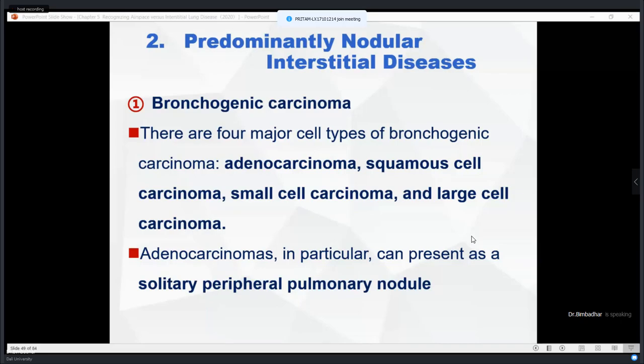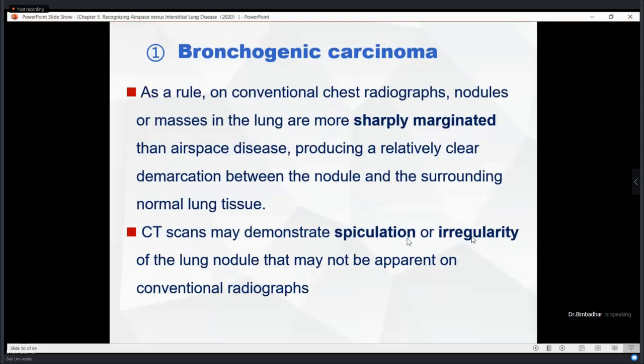Generally, these are invasive techniques. But before that, we can also do staging or a preliminary analysis on a CT scan itself. Now let us see what exactly the features are.